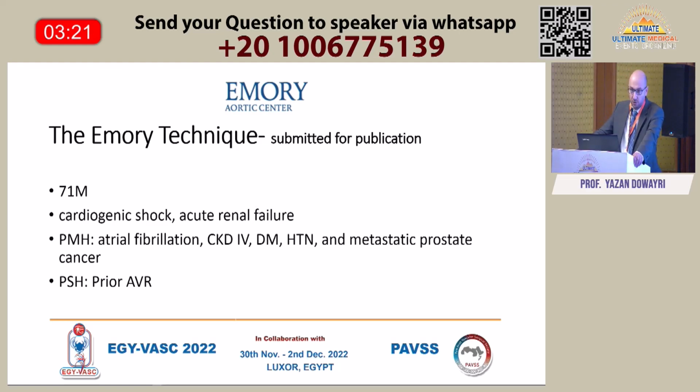This is a new case submitted for publication. This is the first time where it gets presented. This is our technique in Emory that we utilized. As opposed to the prior two cases, we did not use a cardiac approach. We used a transcarotid and a transaxillary approach for this device.